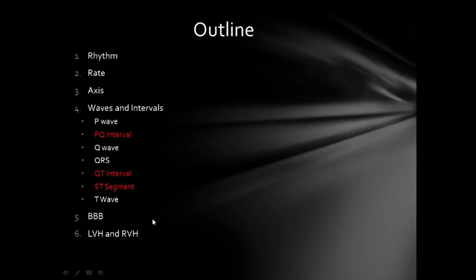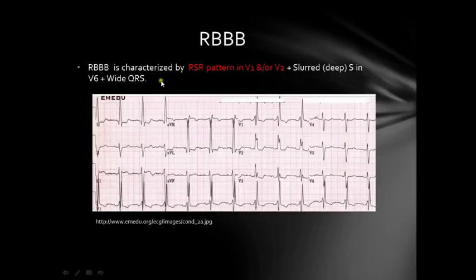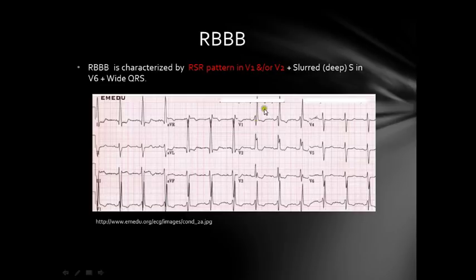To conclude, you can also check for bundle branch block and hypertrophies. A bundle branch block means a block in either the right or left bundle branch — the left bundle branch has three branches: the posterior fascicle, anterior fascicle, and septal fascicle. Right bundle branch block is most characteristically identified by the RSR' pattern in V1 and/or V2 — you can see the RSR' pattern in V2 and V1, meaning you get two R waves. There is also a deep S wave in V6, but the most important sign is the RSR' pattern in V1 or V2.